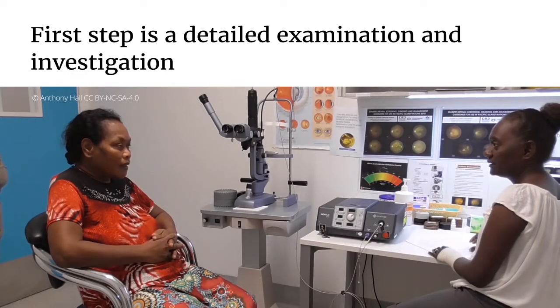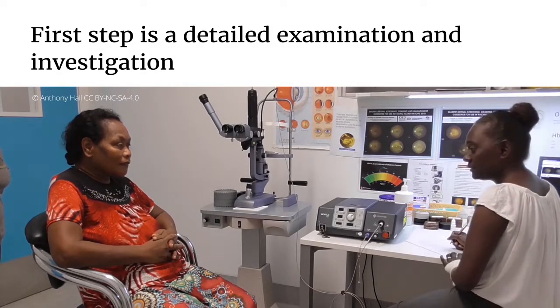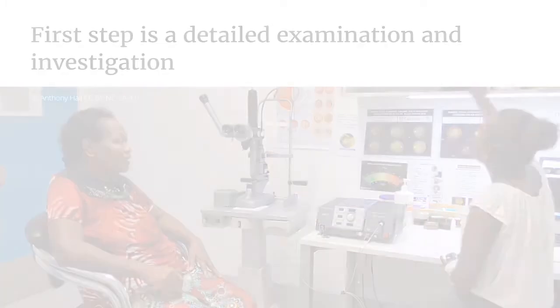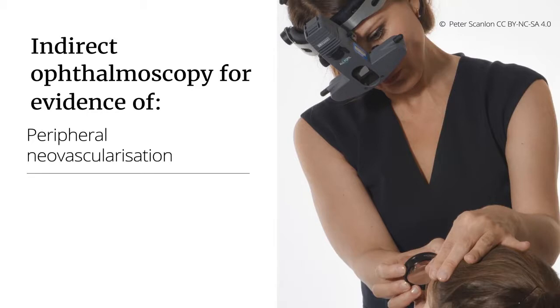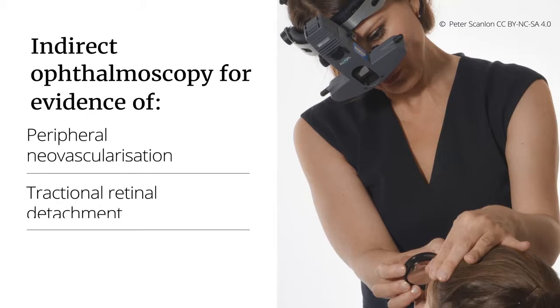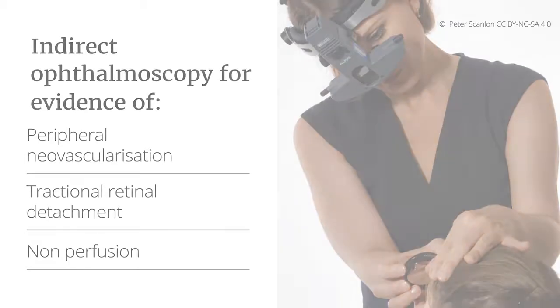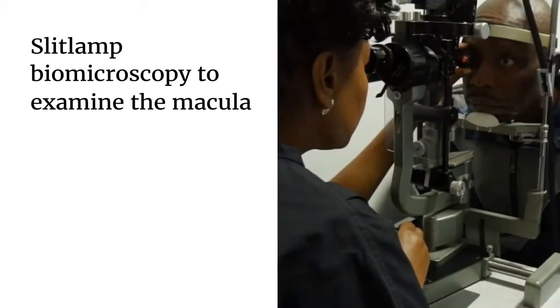Once a patient has been identified as needing treatment for diabetic eye disease, the first step is to examine their retinas in detail using an indirect ophthalmoscope and slit-lamp biomicroscope. Indirect ophthalmoscopy is useful for looking for evidence of peripheral neovascularization, retinal detachment, and ischemia, areas with capillary blockages. The macula is examined with the slit lamp and a variety of lenses.